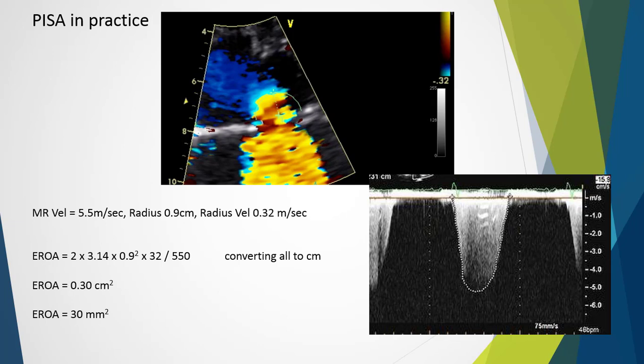The radius of a hemisphere is difficult to determine under normal imaging settings. To ensure the best representation, the color baseline is moved in the direction of the flow. For example, in most instances, this is downwards for mitral regurgitation and upwards in mitral stenosis.